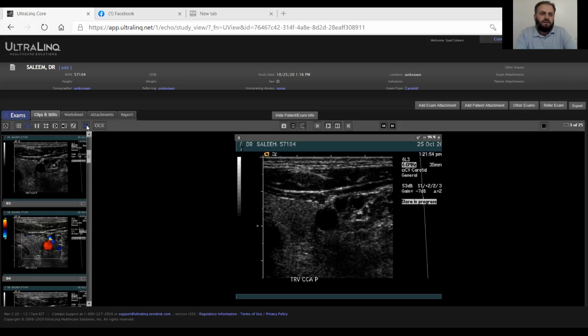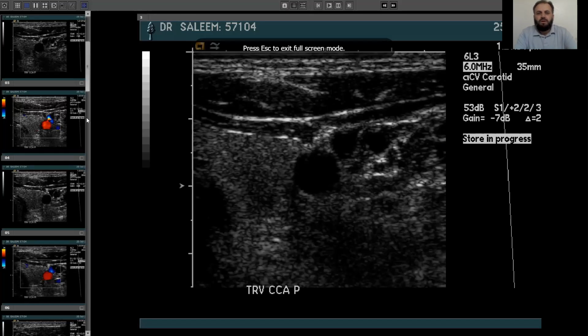If you guys are okay, this is one of the carotid arteries. We have to work on our landmarks. For us, it is very important to see what the landmarks are from where we scan. For example, on these images we're looking for the carotid artery. To specify the disease, any kind of pathology, we divide the carotid artery into segments. So we have to put them as prox, mid, and distal portions of the carotid artery or common carotid artery.